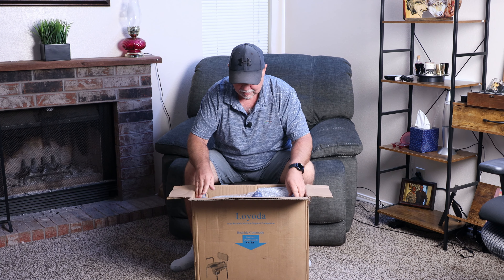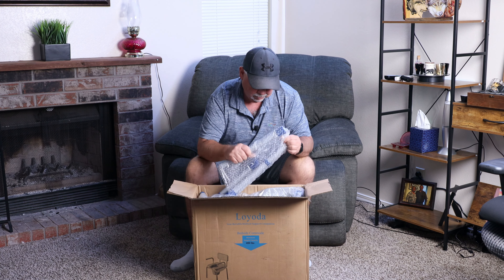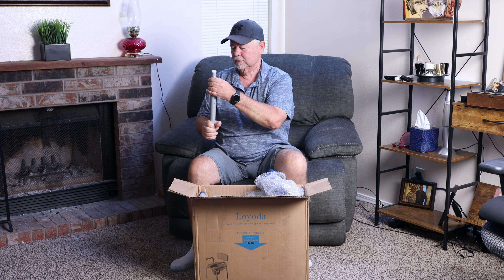It's all folded up nicely in here. I think we're going to have to put it together a little bit. This is heavy. Looks like the legs are going to be adjustable — they have little push pins right there so you can raise it up and down. We'll look further into that once we get it put together.